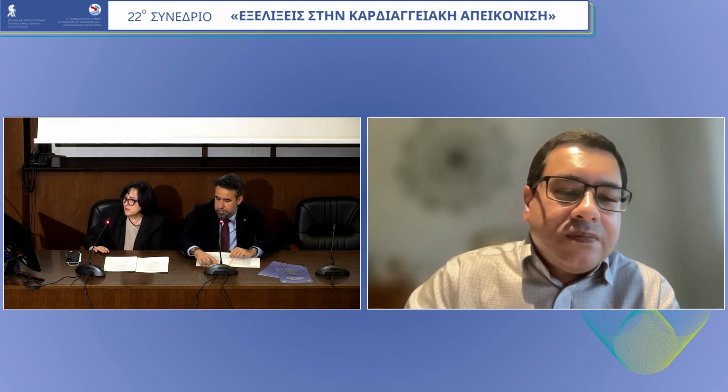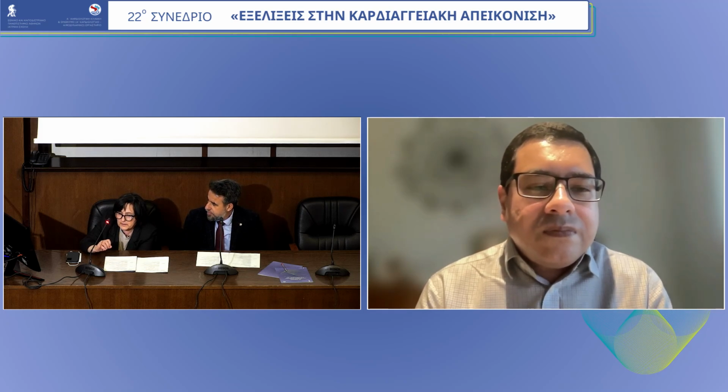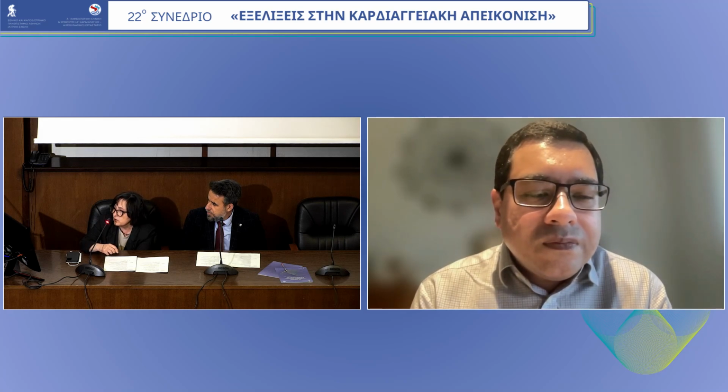Thank you, Sanjeev, for your excellent talk. I have one more question. Do you think that pannus should be just a thickening of the prosthetic valve, and the thrombus is a large mass and not just thickening? From your experience, do you think that pannus should express as a mass or just thickening of the prosthetic valve?